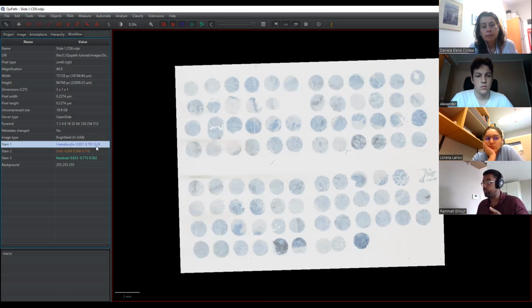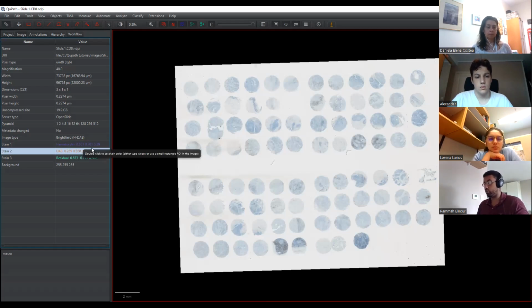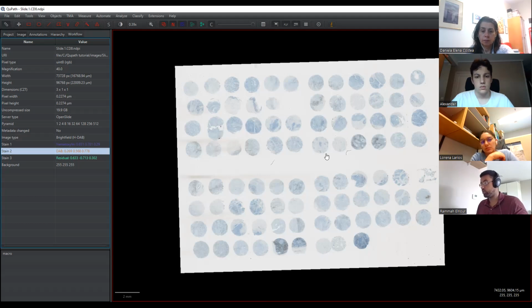If these numbers are completely wrong, you won't be able to detect the cells, because the detection is based on the hematoxylin blue of the nuclei. The same goes for the surface marker: if these numbers are completely wrong, you won't be detecting the correct surface markers. So you can manipulate these parameters to make sure that the software picks up the cells correctly. But I'll show that afterwards.